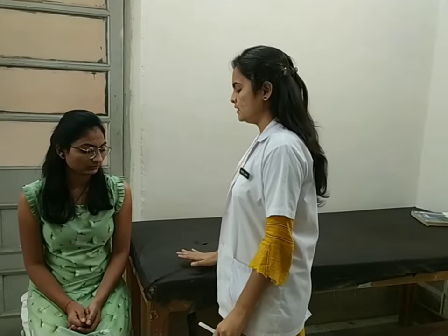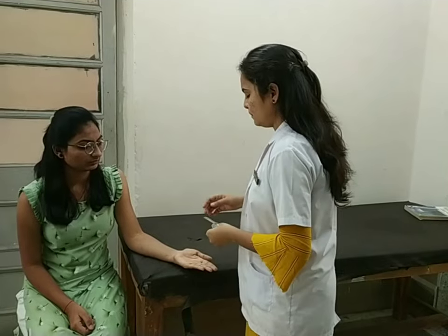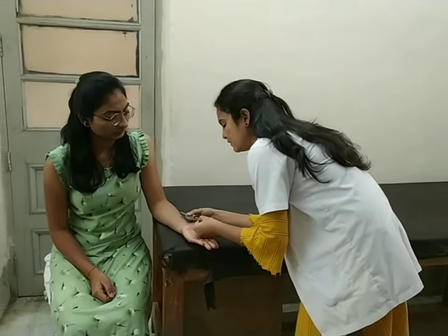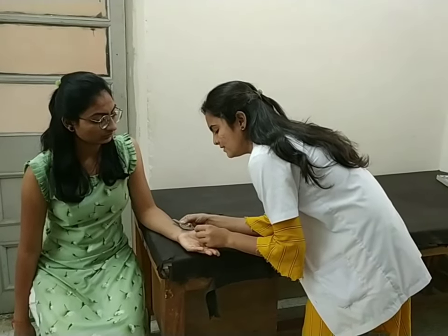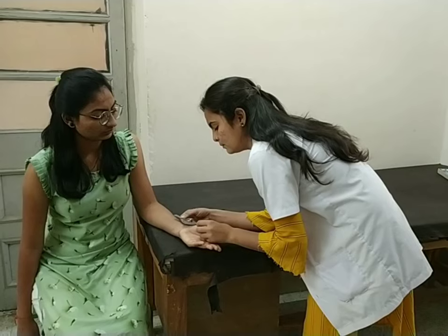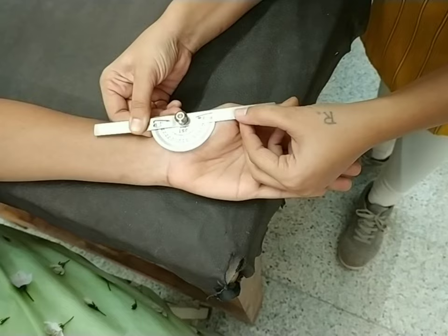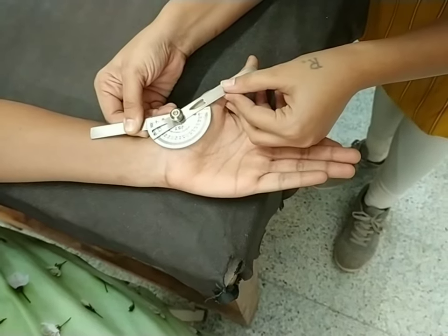For carpometacarpal joint extension, position of the patient sitting on a chair with forearm and palm fully resting in full supination. Fulcrum over the palmar aspect of the first carpometacarpal joint. Stable arm over the ventral aspect of the radius and moveable arm over the ventral aspect of the first metacarpal. Ask the patient to move your thumb away from your palm. Normal range of carpometacarpal extension is 0 to 15 degrees.